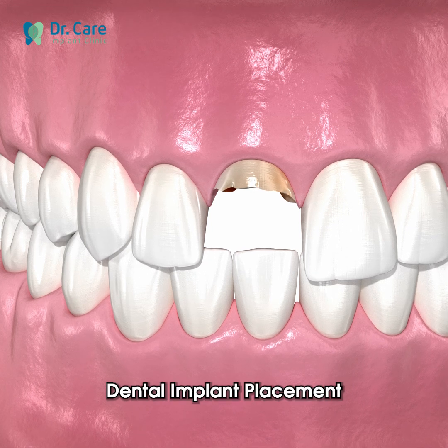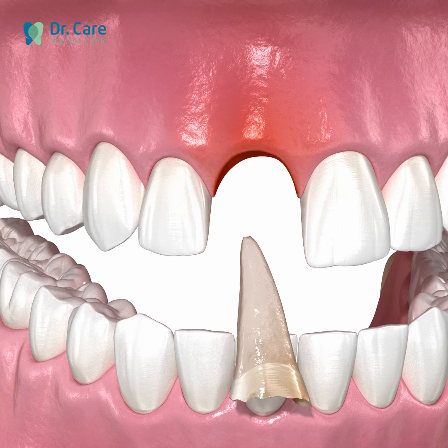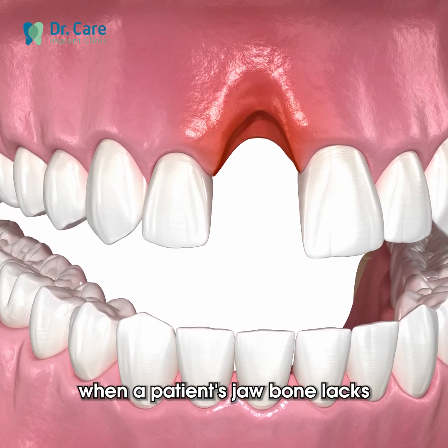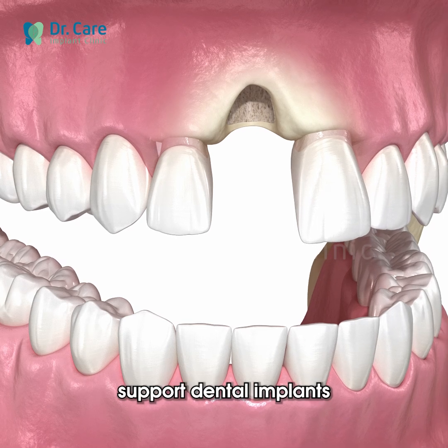Jawbone grafting in dental implant placement. Jawbone grafting is an advanced dental procedure typically indicated when a patient's jawbone lacks sufficient density or volume to safely and effectively support dental implants.